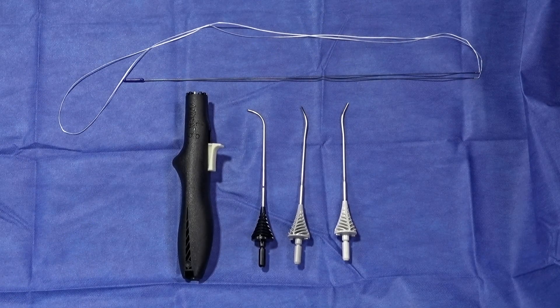We often prefer to use inside-out meniscal repair because we find tremendous advantages to the smaller diameter needle, the ability to very accurately place a needle, and to anatomically reduce meniscus tears of all types. One of the challenges has been the number of hands or people in the operating room required to successfully repair menisci with this type of technique.